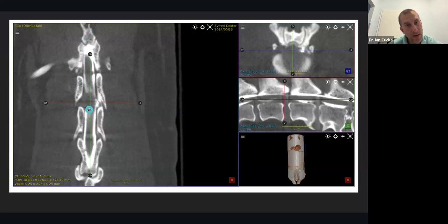And then the line of the myelo is continuing on the right side here. On the left side, you can see it's quite clear, and there is a bump here. So the disc material was pushing to the left side, and there was some deviation of the spine by the disc material.